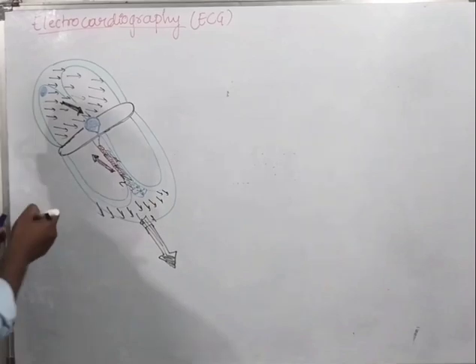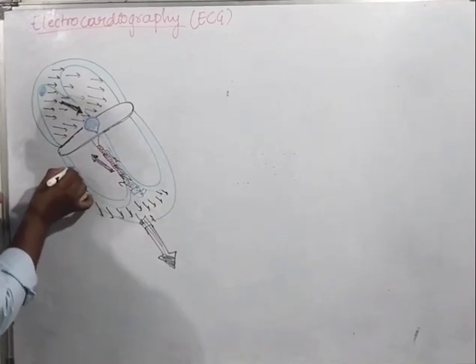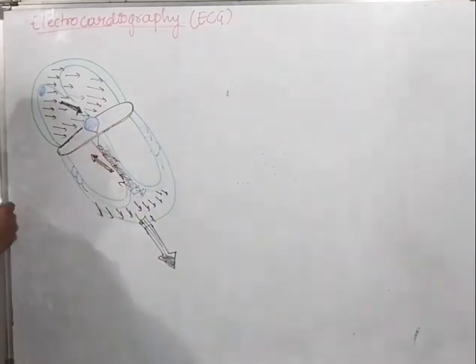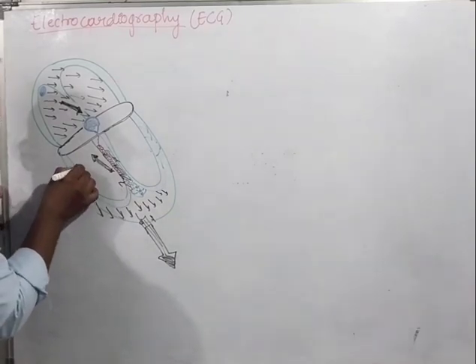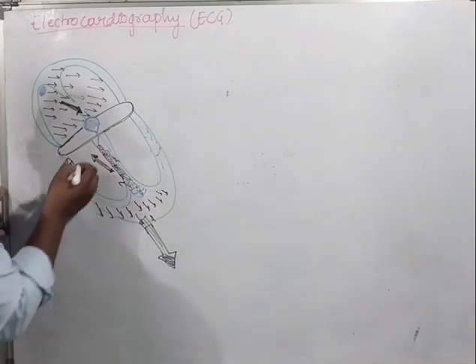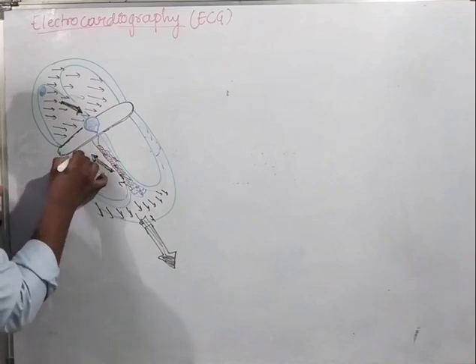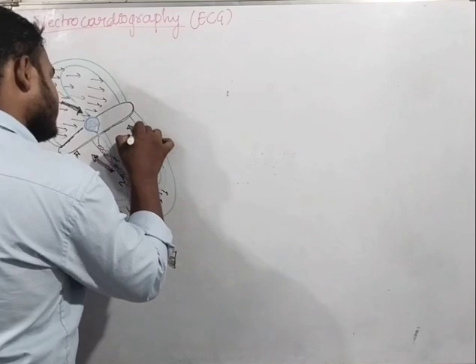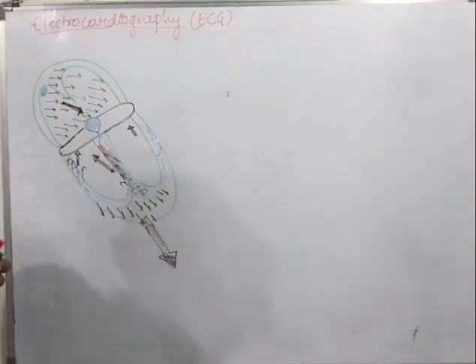Okay, and next, the myocardial fibers, the Purkinje fibers, are distributed like this, and here the impulses are generated in an upward direction. The resultant of this vector is like this. Okay, it is also rapid.